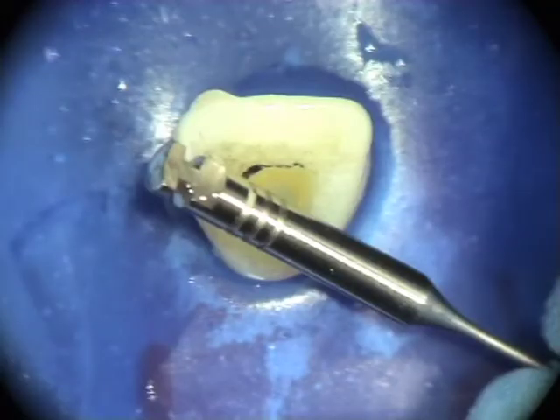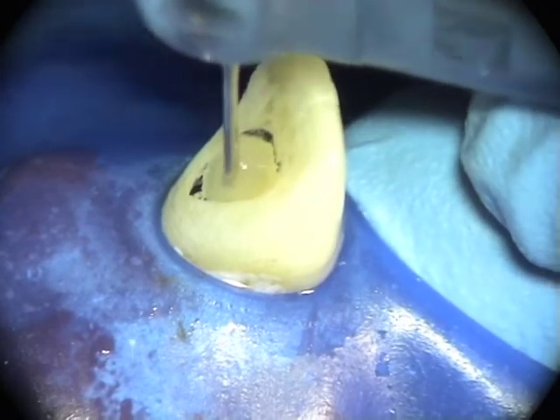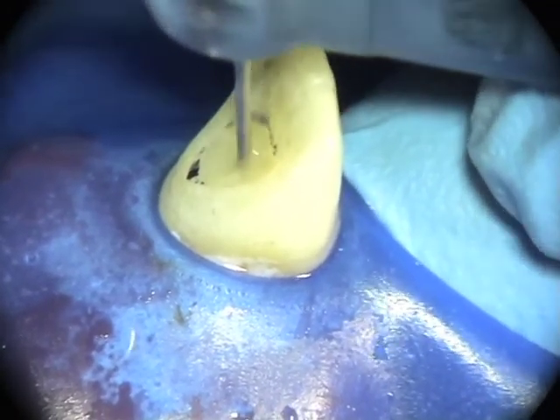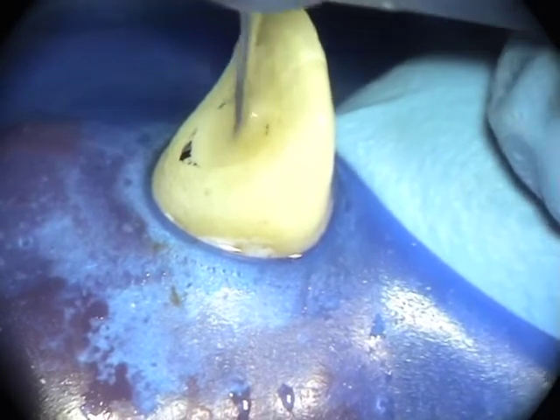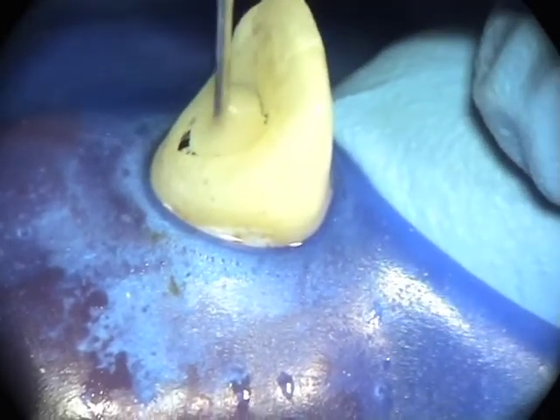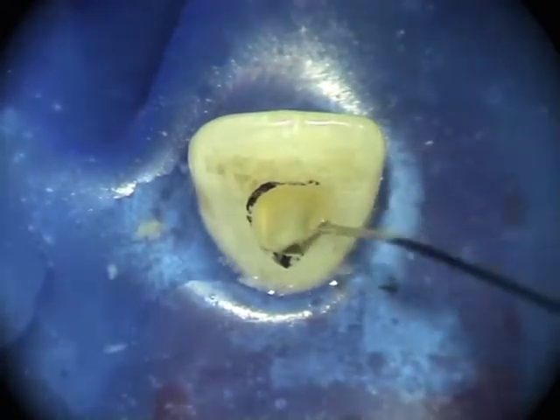The next size smaller burr, a number 3, is selected and the process repeated. Once again, it is important to irrigate to remove any dentine debris.